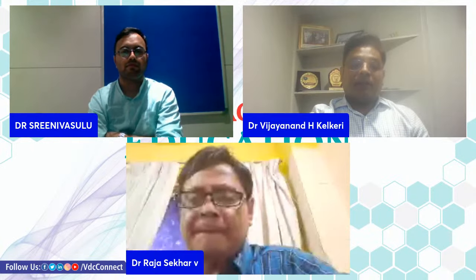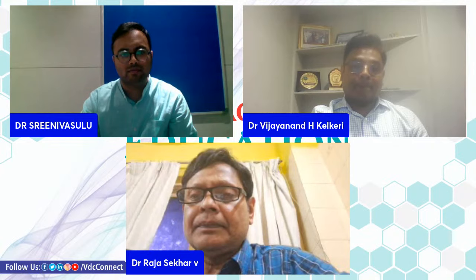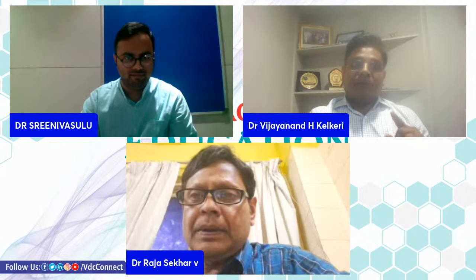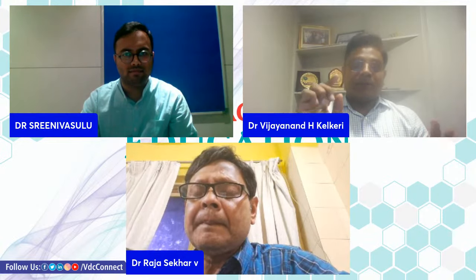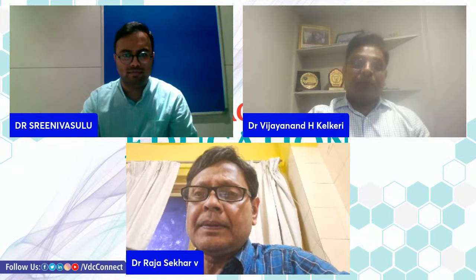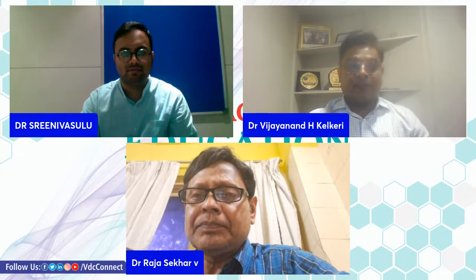At the earliest point, I'm talking about the marrow edema part. But if there is a clinical history which is matching, marrow edema gives a comprehensive diagnosis. What happens here is, if the clinician and the radiologist interact together, we can come to a single point diagnosis. Otherwise, if there is no suggestion from the clinician, the doctor goes blindly, the radiologist goes blindly. There are, as I told you, 5-6 differential diagnoses. We'll put one among them there and leave it.